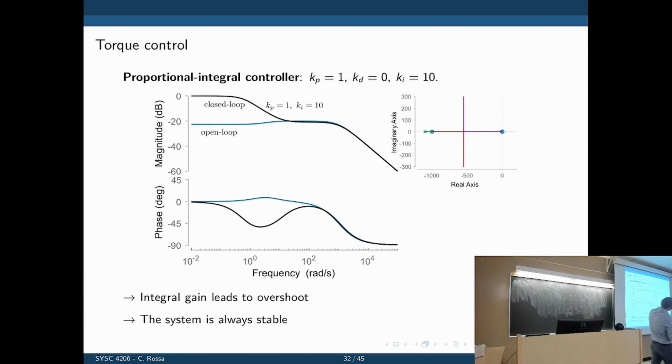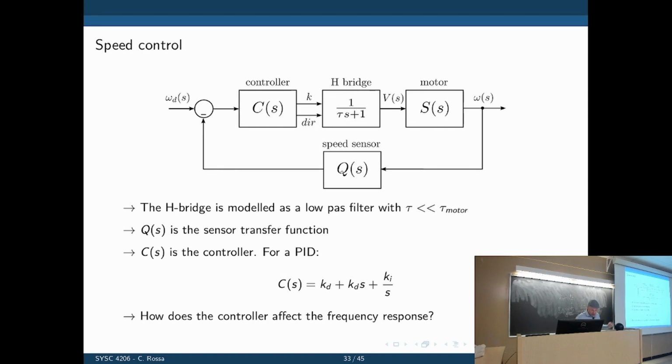That's the root locus for Ki. So if Ki is too big, what's the problem with that? As soon as you touch an obstacle, what is going to happen? It's going to vibrate forever. It will be underdamped. So that's where we have to be careful. It's still fine because you're not making the system unstable, but the addition of the integral controller with a very high gain will completely destroy the feeling you get when you touch a virtual obstacle. But the system is always stable.